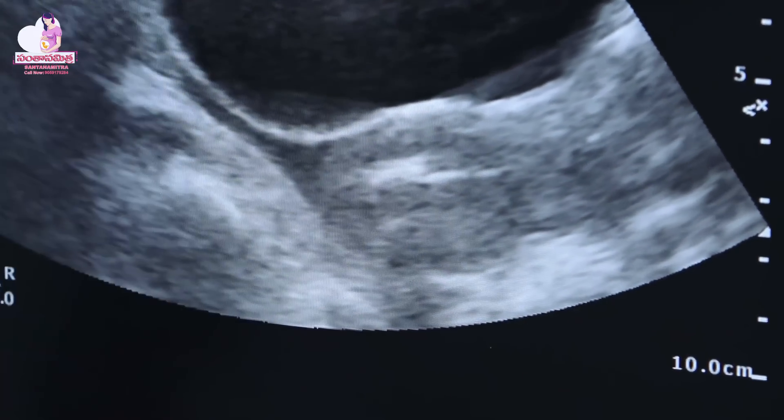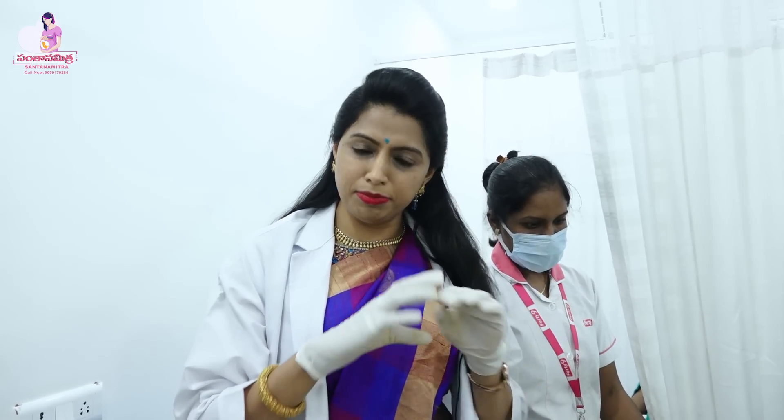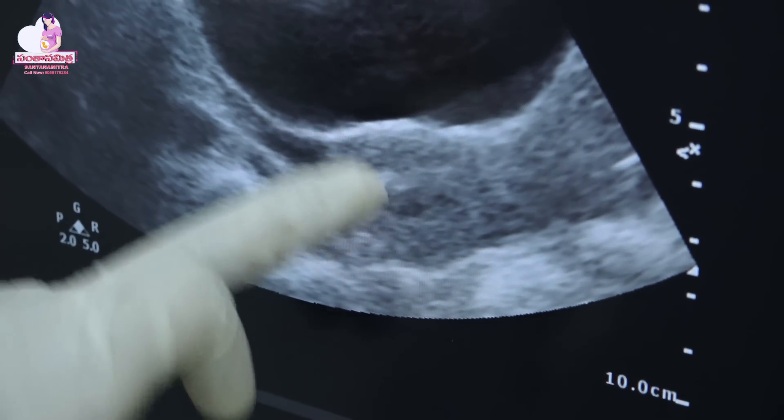We insert the husband's sperm inside the uterus. The patient should lie down for 5 to 10 minutes after the process. This is the endometrium cavity. After this process, a lady will do IUI and after 5 to 10 minutes she will take rest, lying down in her particular position. After 5 to 10 minutes, the doctor will give a prescription.